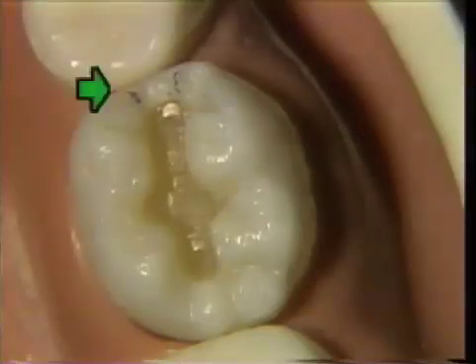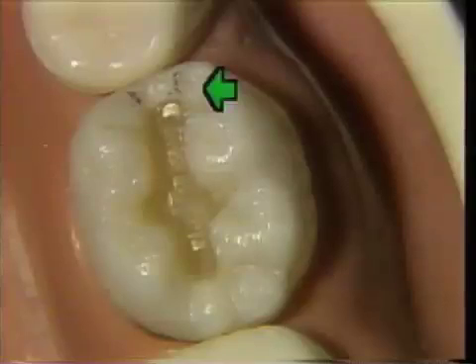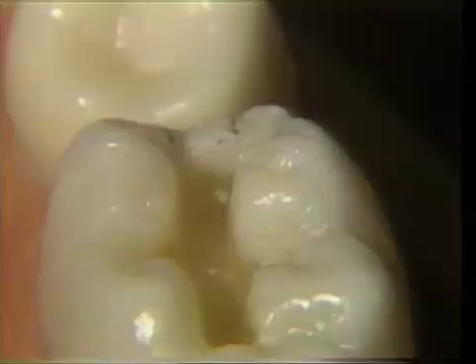As an aid for the proper extension of the proximal box, pencil marks should be placed on the tooth surface to indicate the projected buccal and lingual extensions that will be accomplished with rotary instruments.